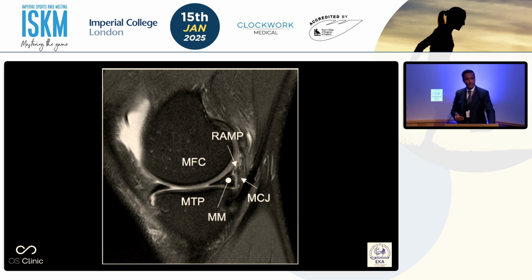When you're looking at your scans, do look for them on the sagittal views of the knee joint. And if you look carefully, you can often pick them up. So this is a sagittal view on the medial side of the knee. You can see the semimembranosus is quite close to where we'd normally see a ramp tear. And you can see just behind the medial meniscus a vertical line demonstrating where the tear is. So just at the back here.